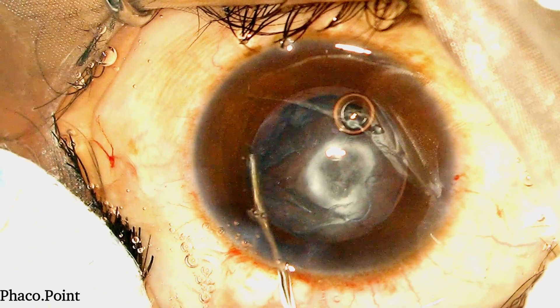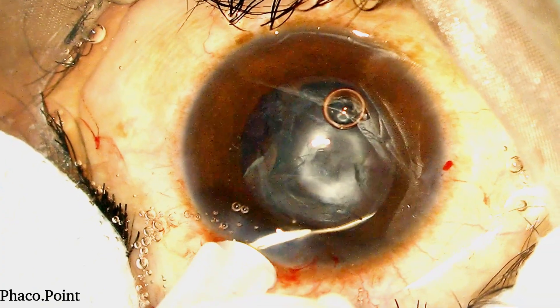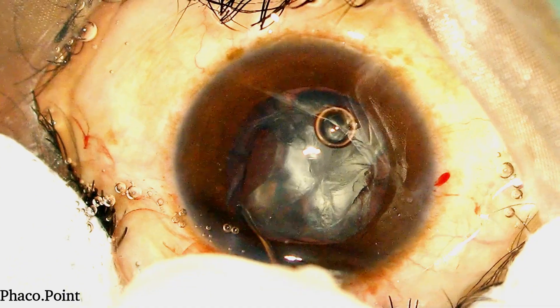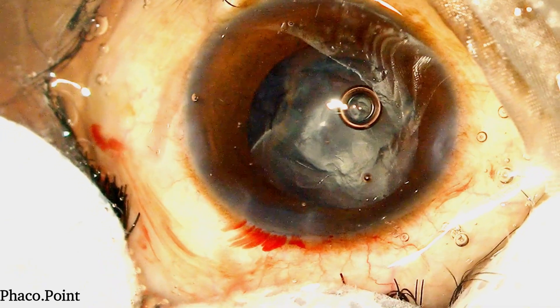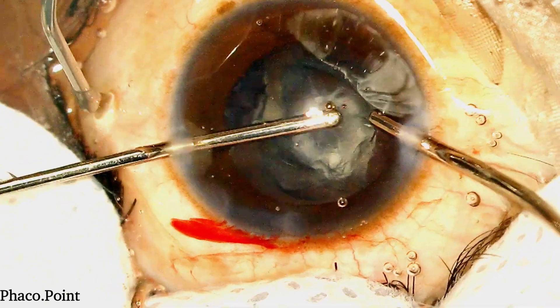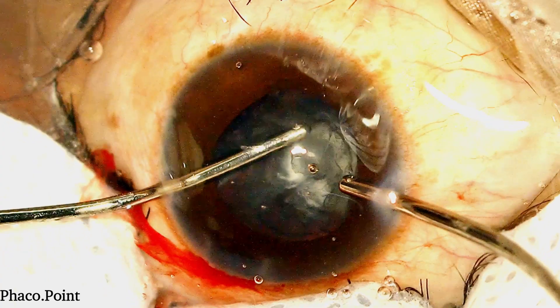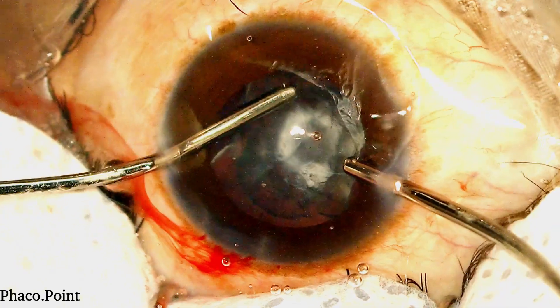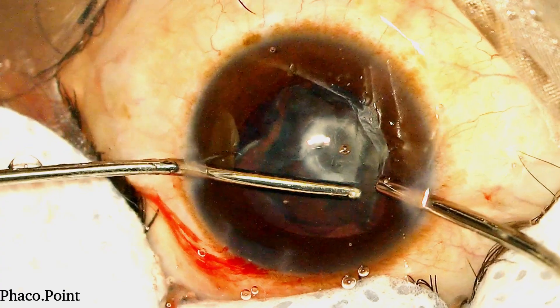We now perform a visco-dissection of the epinucleus. This enables us to loosen out the epinucleus from its equatorial part, get it to prolapse out towards the centre, thereby facilitating its easier removal. Because the capsular bag is empty and there is no nucleus there, this step does not increase the pressure within the capsular bag and doesn't have an added risk of compromising the posterior capsule. You will see how we use the bimanual irrigation aspiration to remove this epinucleus shell. Note how I hold onto the epinucleus more towards the periphery and draw it out towards the centre, ensuring that I do not cross over to the opposite side. I tend to loosen it from all four sides, bringing the loose parts into the centre prior to their subsequent aspiration and removal.